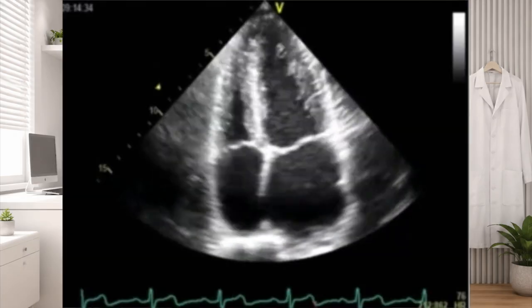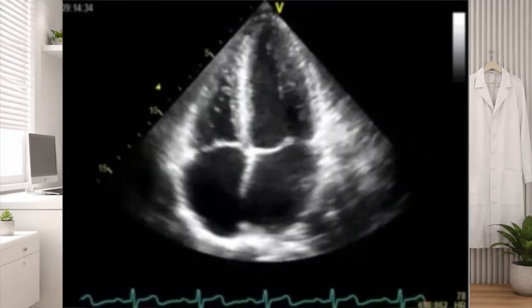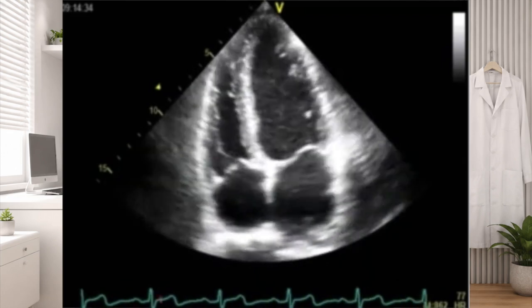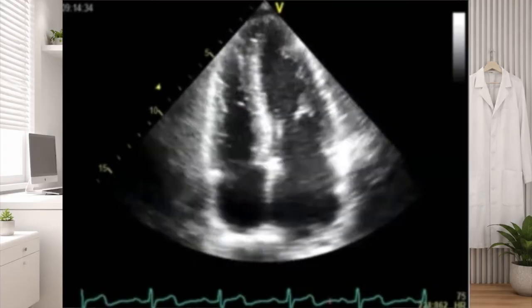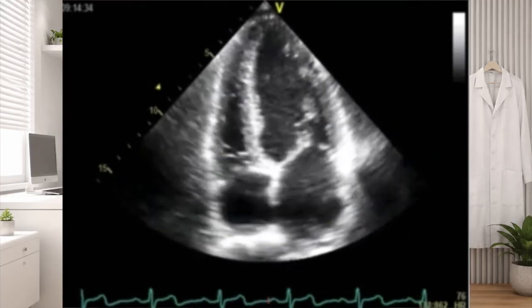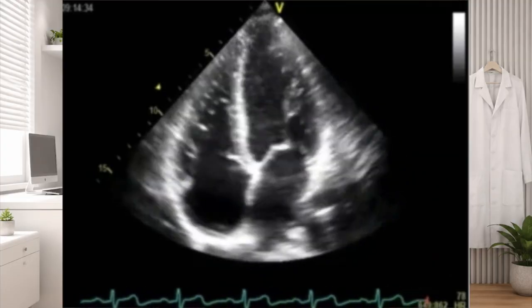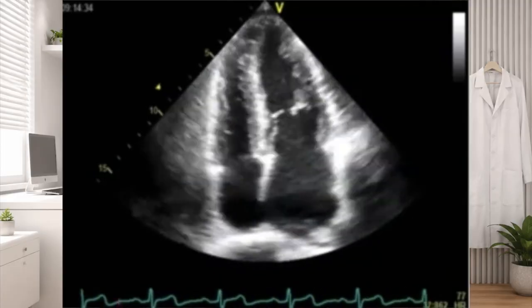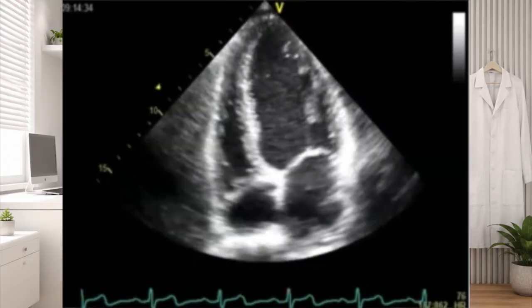The last motion, third, rotation. This is especially important when you're trying to assess the right ventricle. A small change in the probe rotation can make the right ventricle appear dramatically small or absolutely large. So I rotate the probe gently until I can see the right ventricle at its maximal dimension, with both the tricuspid valve leaflets moving very clearly. Now, never diagnose right ventricular dilatation from a single image. It may be poorly aligned. So first optimize your probe position, rotate it, compare the right ventricle with the left ventricle, then do your assessment.